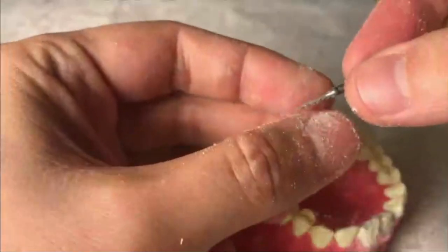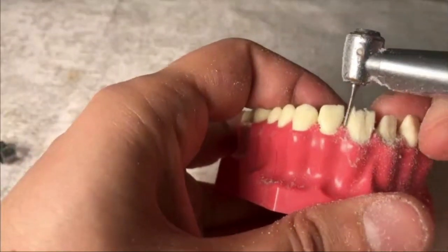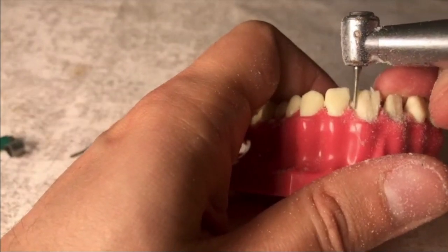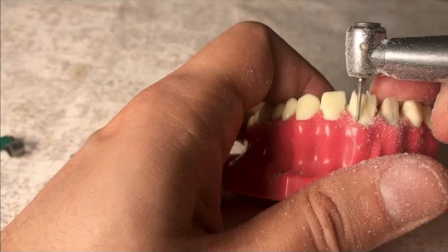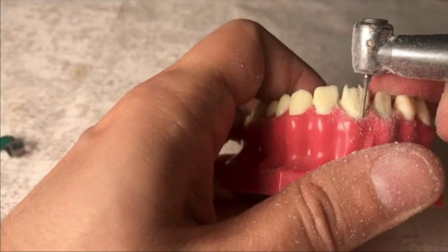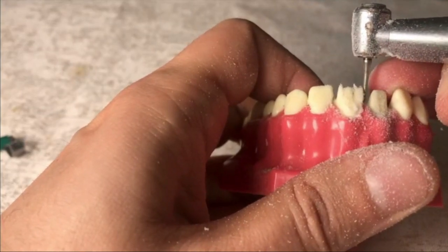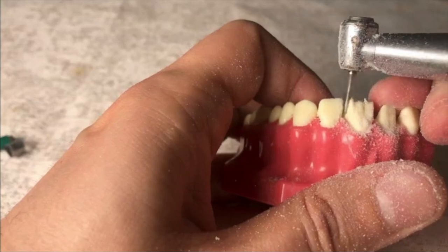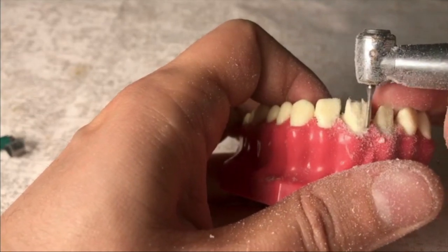When I think I have reached sufficient width for the shoulder burr, I remove the flame end burr. I continue my buccal step from axial to palatal. It is important that this step or bevel is on a single level. We don't want steps that don't have integrity.